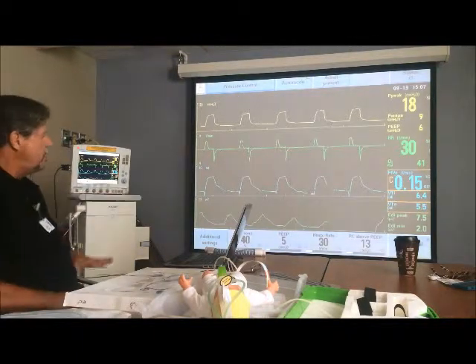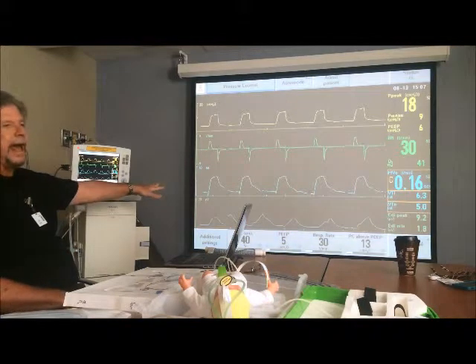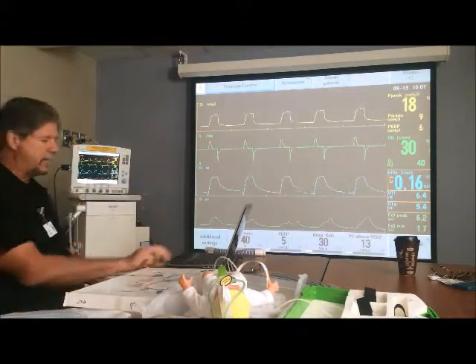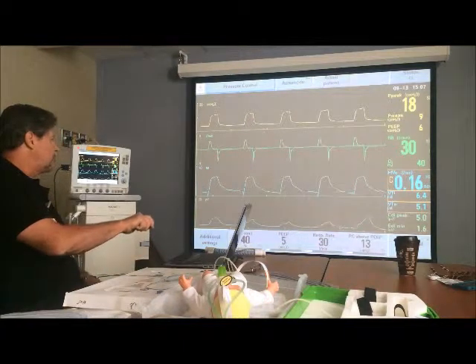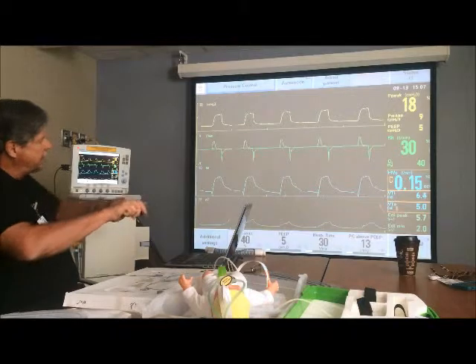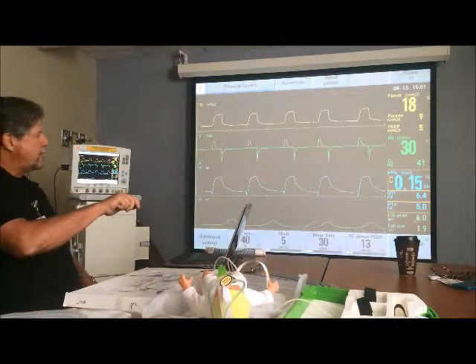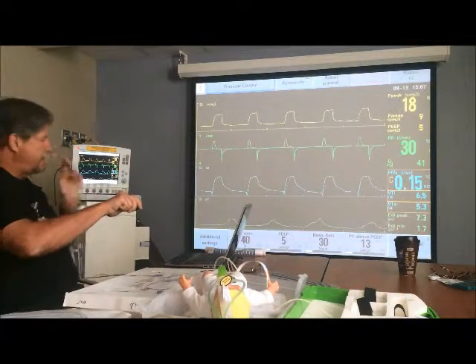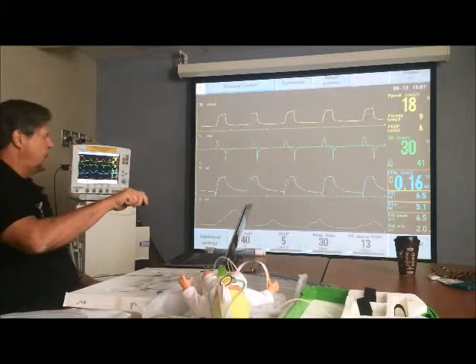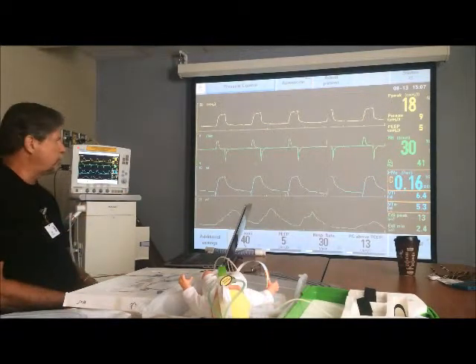But there it is. So we put the catheter in, he's still in pressure control, but all of a sudden now we've revealed what the electrical activity of the diaphragm is doing. So we see that down at the bottom, and we see contraction, relaxation, contraction, relaxation. And when we plug the catheter in, everything moves up and makes room for the EDI peak and the EDI minimum. Okay? And that little U and the V is the microvolts. So remember what I said normal is 10 to 15 microvolts to move a normal tidal breath.